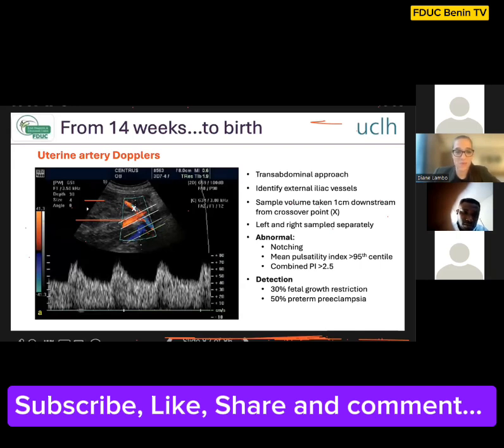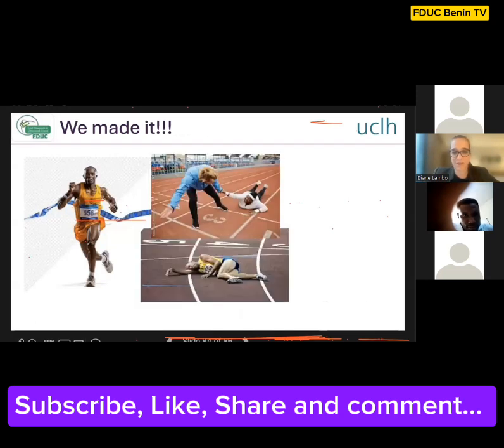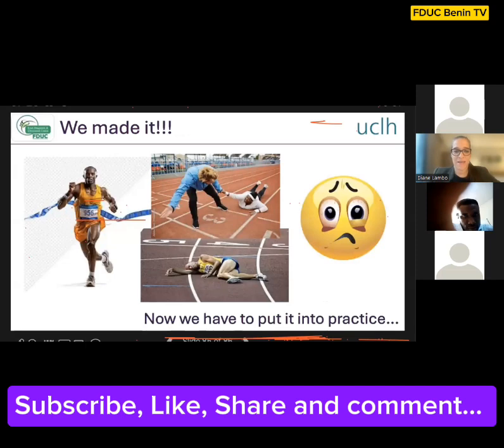So that's a whistle-stop tour through first, second, and third trimester ultrasound. It's a lot of information. I would encourage you, as I said, to really look at those guidelines. I'm sure some of us are feeling that we've sprinted to the finish line and we're happy and we've absorbed all of it and we're now experts in obstetric ultrasound. Others perhaps feel a little bit less optimistic and wonder how they'll ever understand all of this information. Certainly this is how I felt many years ago when I was training. But really what you have to do is put it into practice.